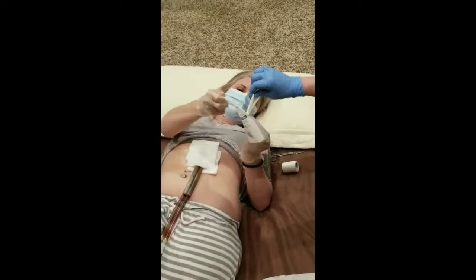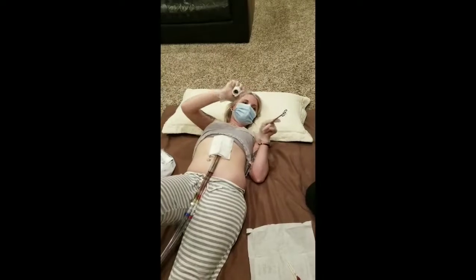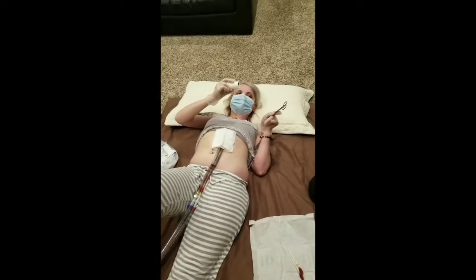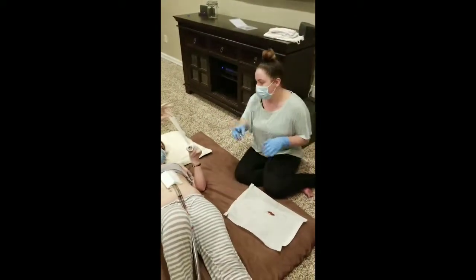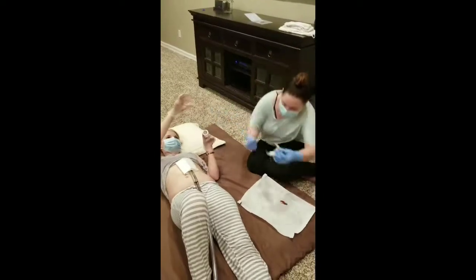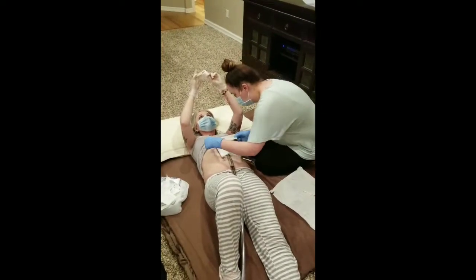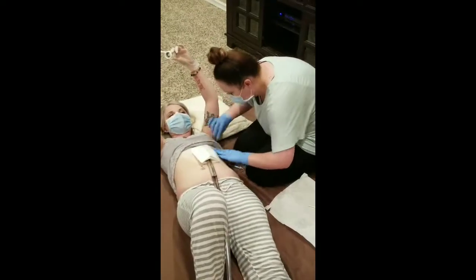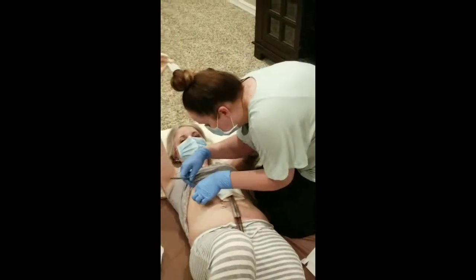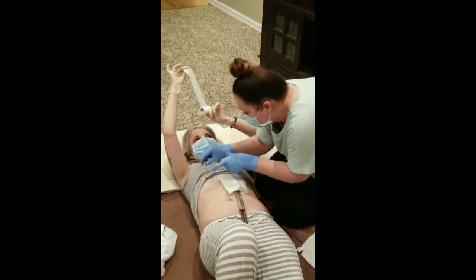Top it off, take this cover, cover that nicely. So this is the second hardest part for me aside from the gloves — putting on the tape. At this point everything's covered, so that's why I'm touching the scissors. I want to use as little tape as possible. I don't want to come out too far because I don't want to cover up that much skin and have any unnecessary irritation of the skin.